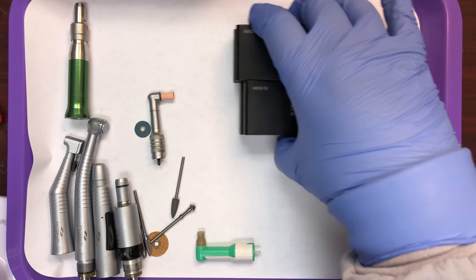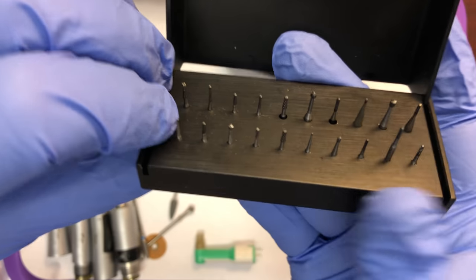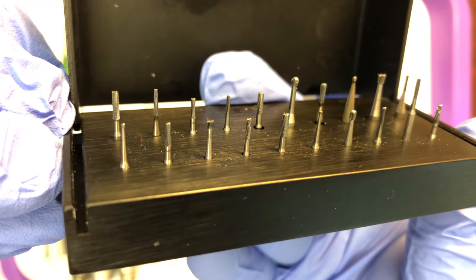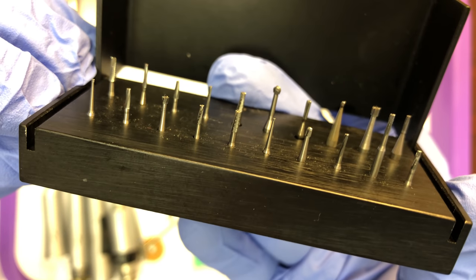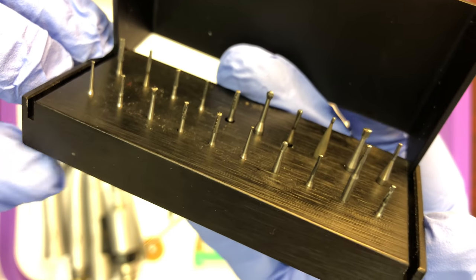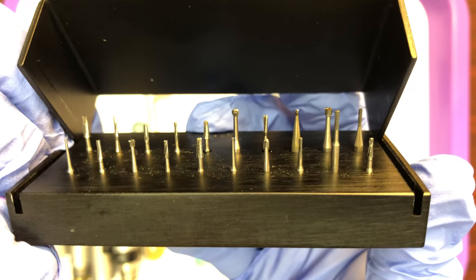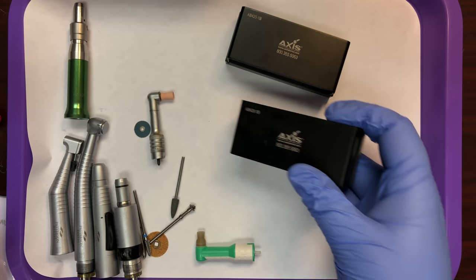Our concentration really for this video is on restorative burrs. Here we have a variety of restorative burrs and we'll go through the different burr shapes so you can see the difference between an inverted cone and a round burr, a round burr from a pear, or a tapered burr from a straight burr. We'll also look at the shanks — the attachment ends.